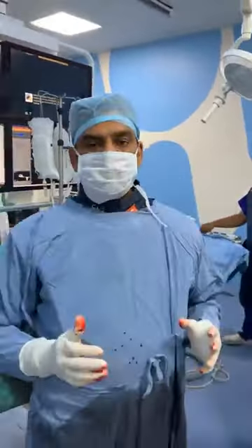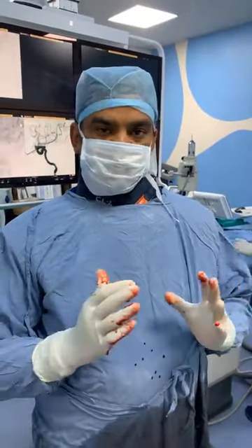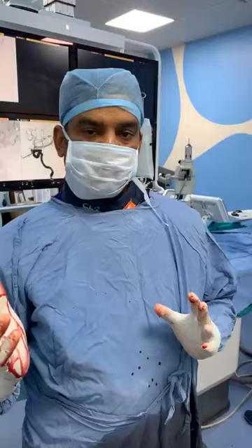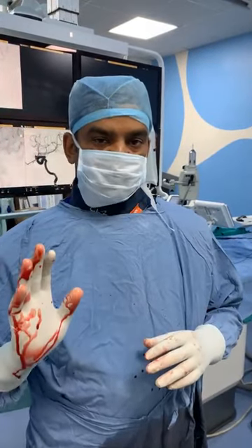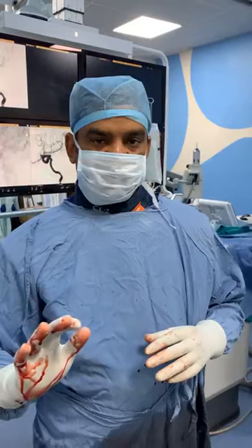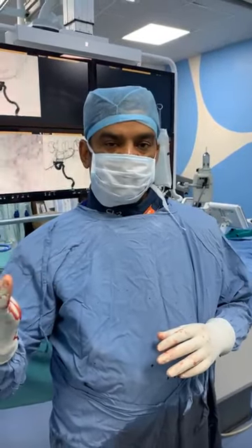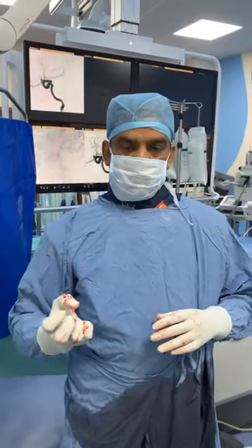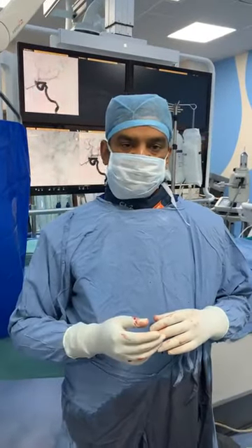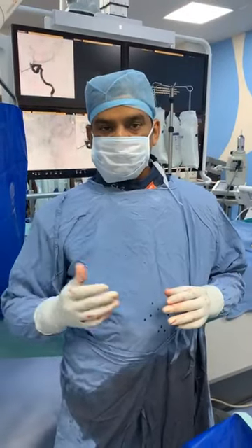So basically flow diverters are a kind of stent with closed mesh which are placed across the neck of the aneurysm. So it dampens the flow. It is not supposed to close the flow immediately. It will dampen the flow inside the aneurysm, hence creating thrombosis. Over a period of time, the aneurysm gets thrombosed. So that's how the flow diverter works. It might take from instant thrombosis to about 3 to 6 months.